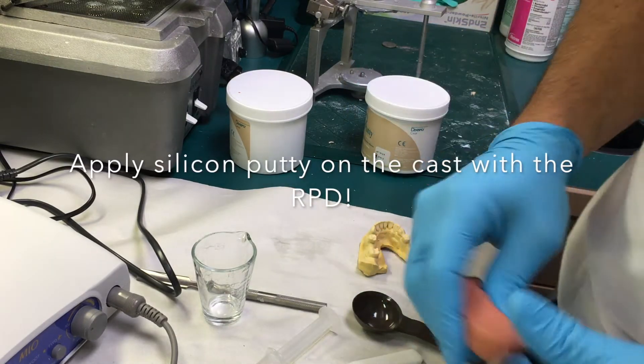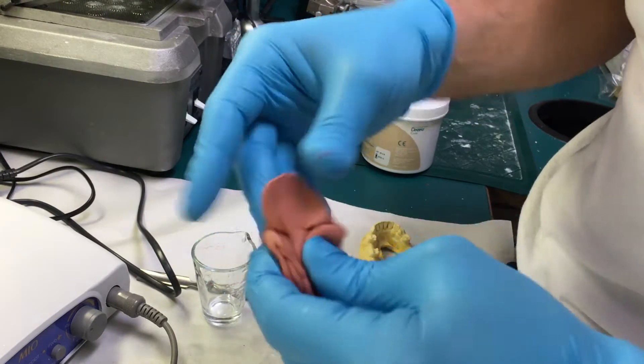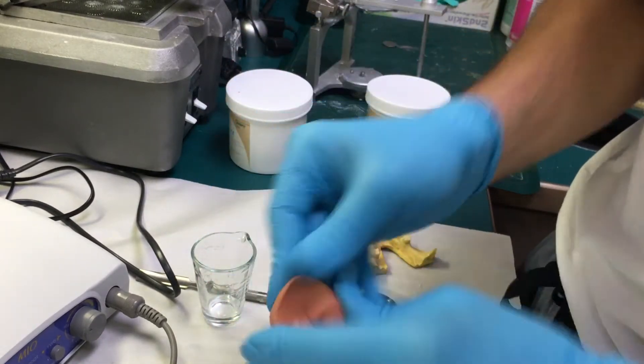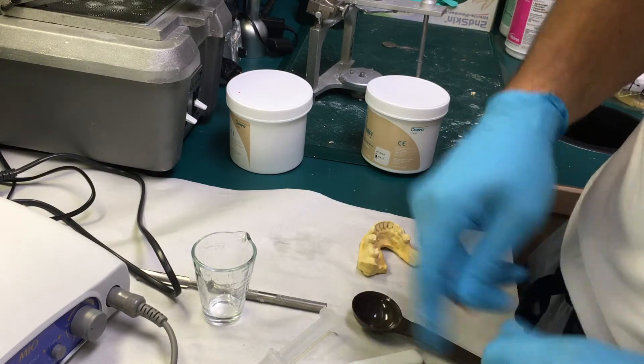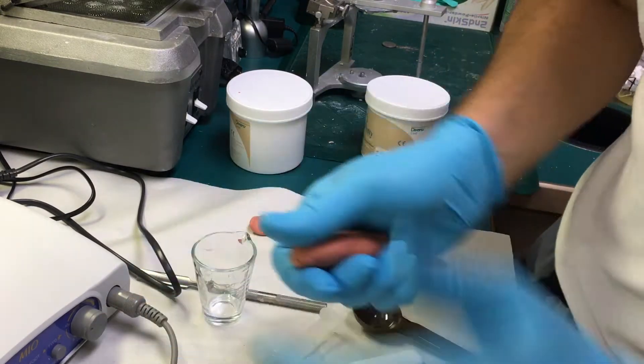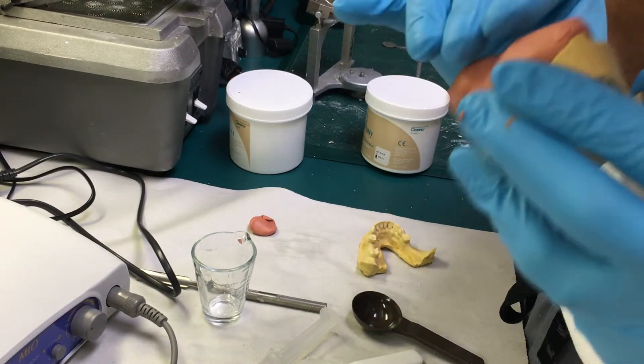Now I have the putty in my hands. It's homogenous in color — you don't want to see any little flakes of white in there. If you do, just go ahead and mix it; it has plenty of working time. Setting time is about five minutes. That's all I need, and what I'm going to do here is apply it like this.